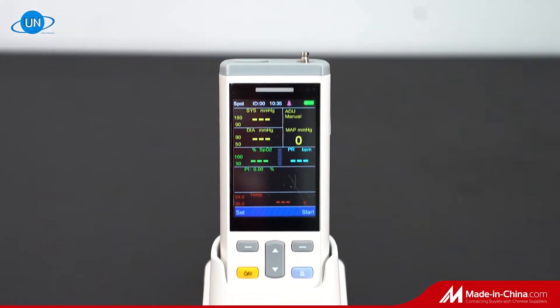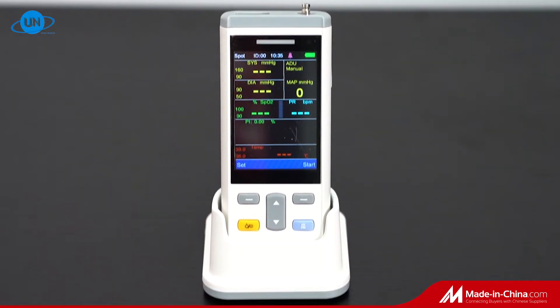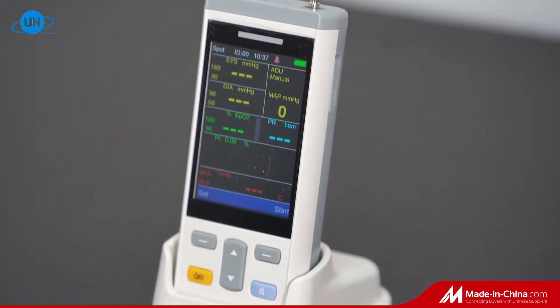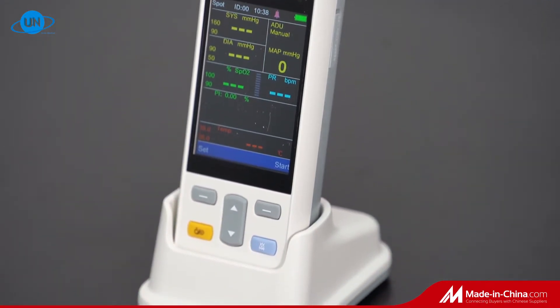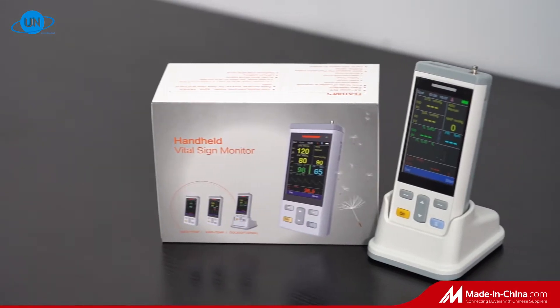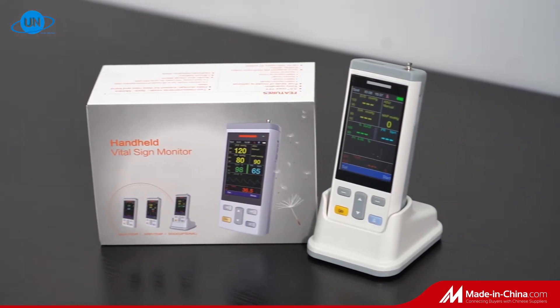Introduction of the Wuhan UN Medical handheld vital signs monitor PC-100. Traditional vital signs monitors are large and cumbersome. Our PC-100 series push the limits on size and bring you a unit that can be taken anywhere.